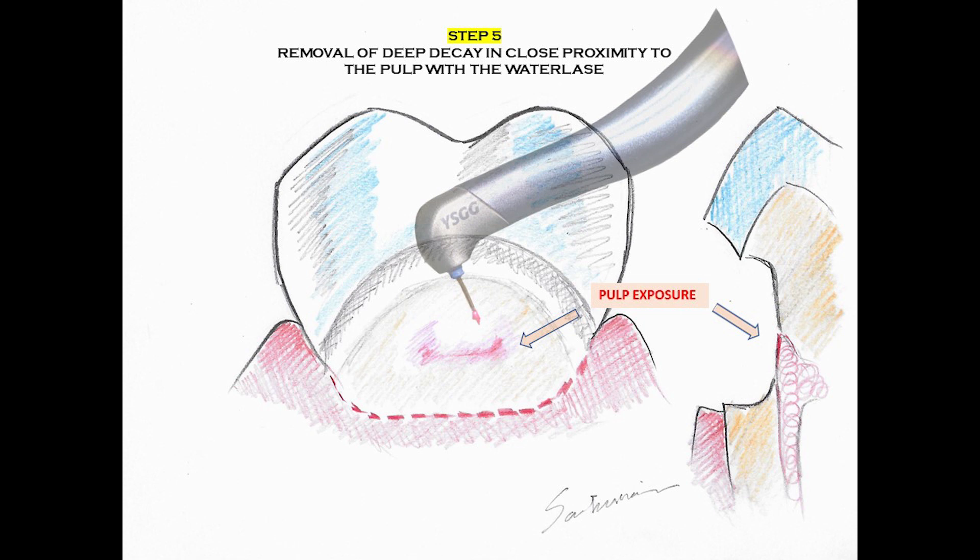The Waterlase is used to remove the rest of the deep decay, and in such cases we always strive to avoid a pulp exposure. However, that may not be possible, especially in very deep cavities. Once we get a pulp exposure, we defocus or just go slower or reduce the power, and we make sure that we remove the deep decay which is covering the pulp roof or the pulp walls.